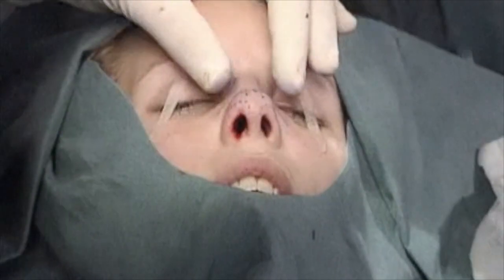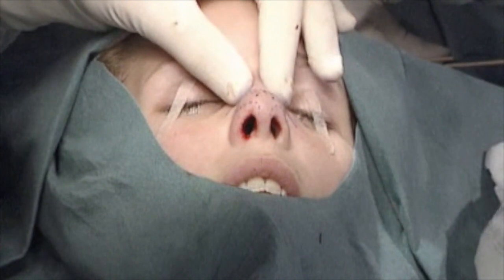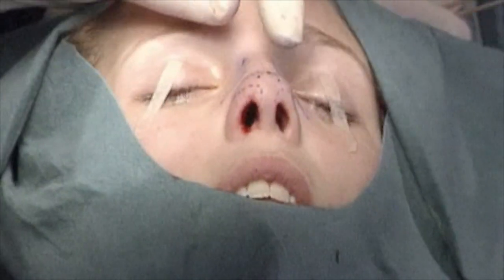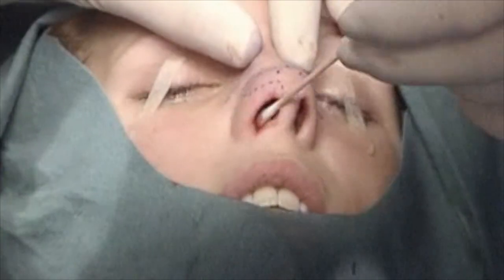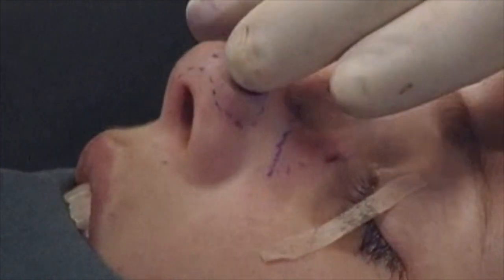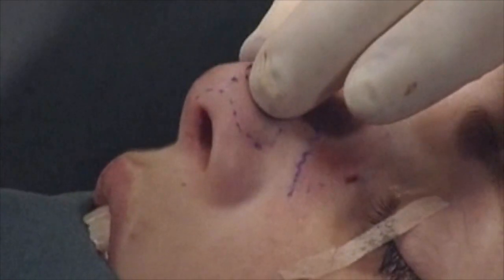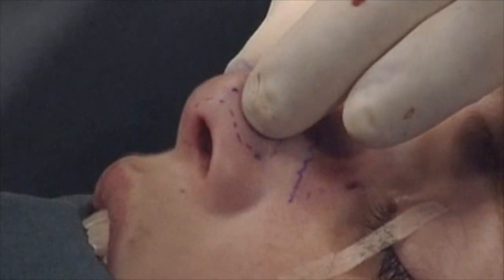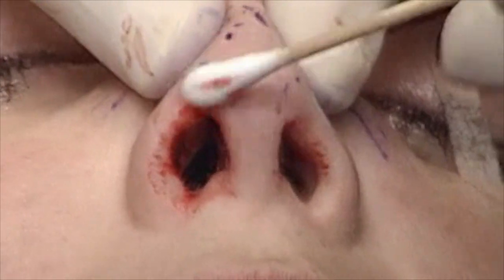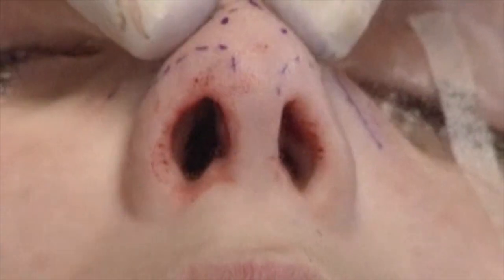So there's a good alignment, realignment of the bony dorsum. We have a nice profile with nice supratip. There's some refinement of the tip, and now we close the intercartilaginous incisions.